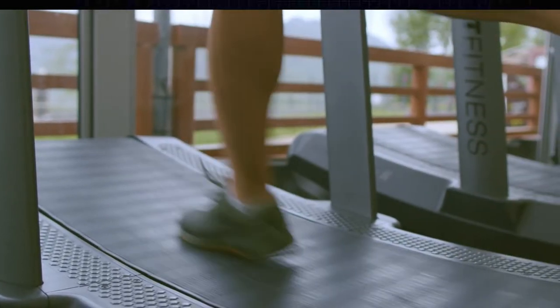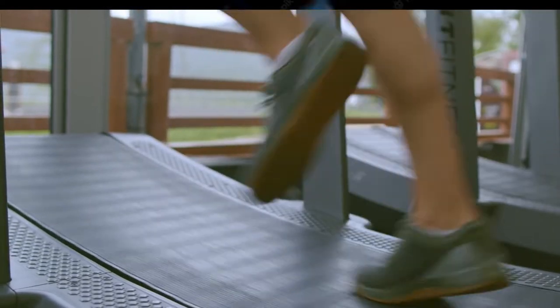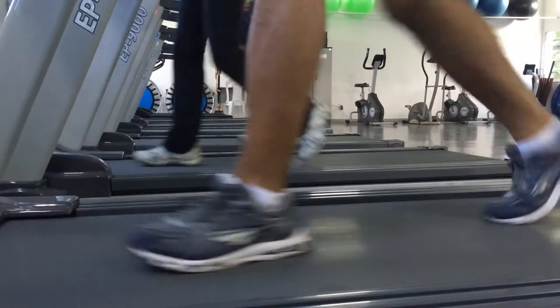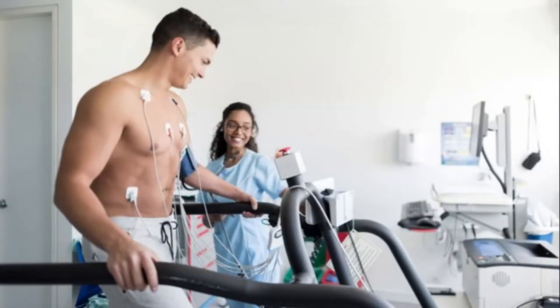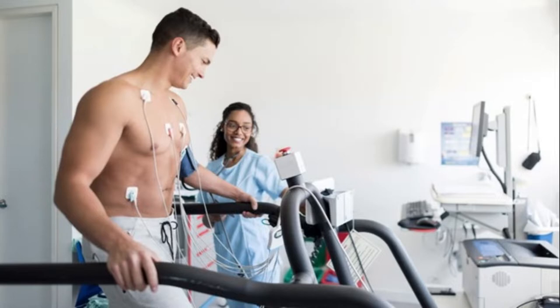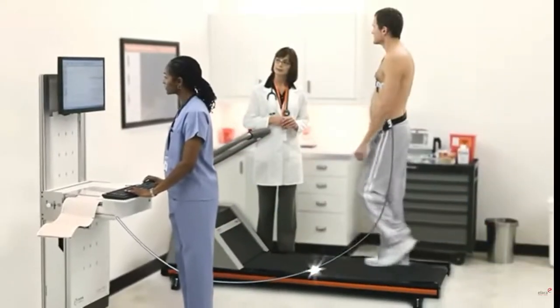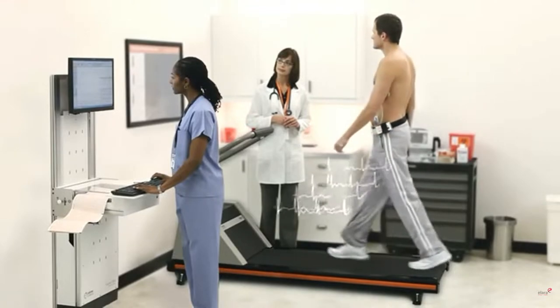Every three minutes, the slope of the treadmill increases and the speed of the machine also increases. We see how much time the patient can exercise. With each stage cycle, one ECG is printed so we can comparatively analyze the ECG reports versus the baseline. Initially, one recording is done at rest and one in a hyperventilating condition before the treadmill starts, then ECGs are printed at each stage. A recovery phase analysis follows, with ECGs printed every minute to track how rapidly ECG changes appear and disappear.